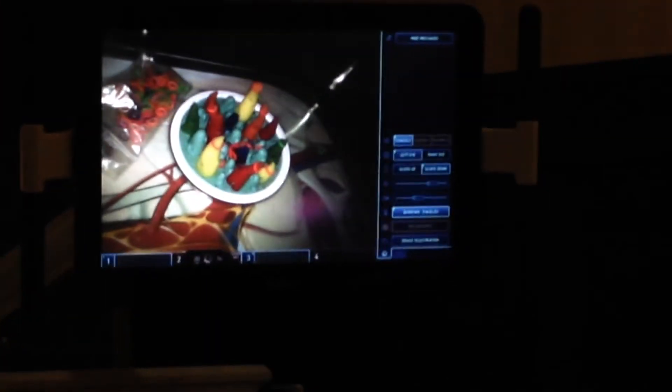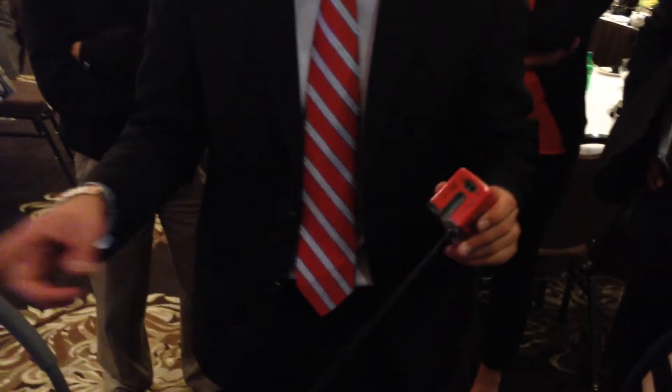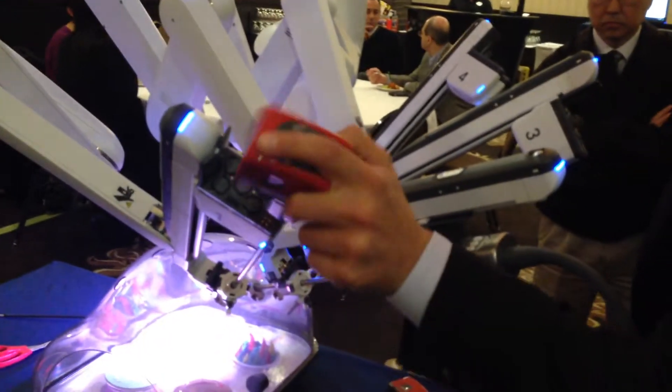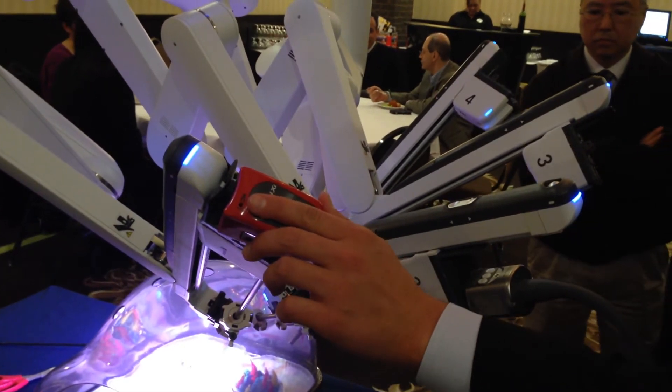The instruments are actually going to have a thinner housing, and they're also two inches longer. So you have actually more reach than you've ever had before. The scope and the instruments are all two inches longer — you have a longer scope, two inches longer than the eight-and-a-half scope.